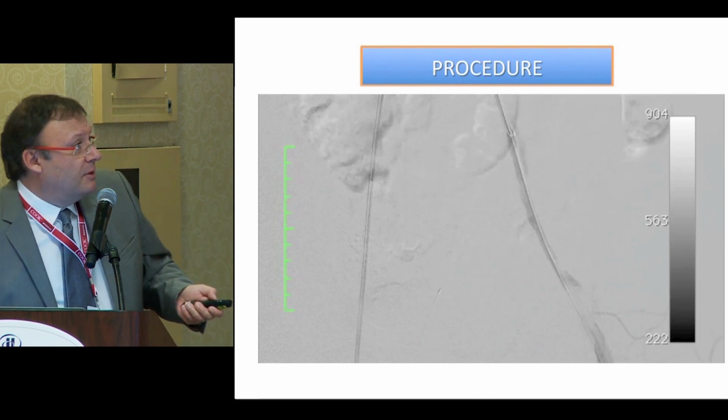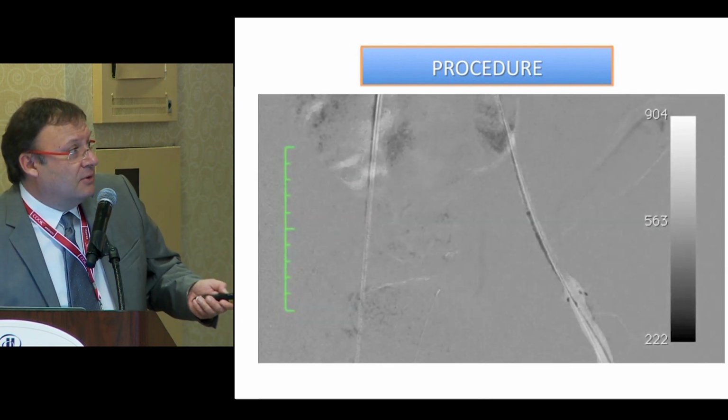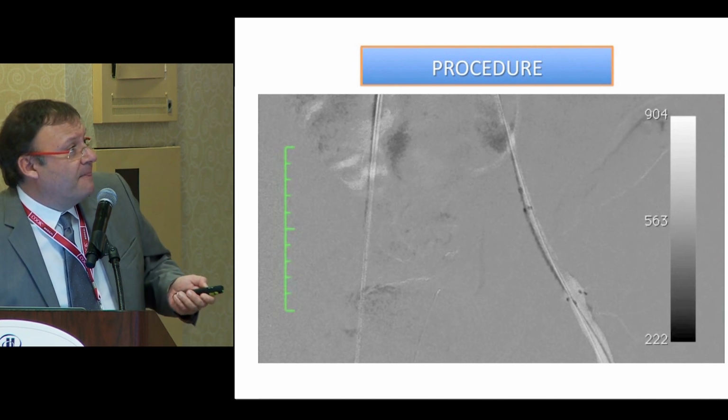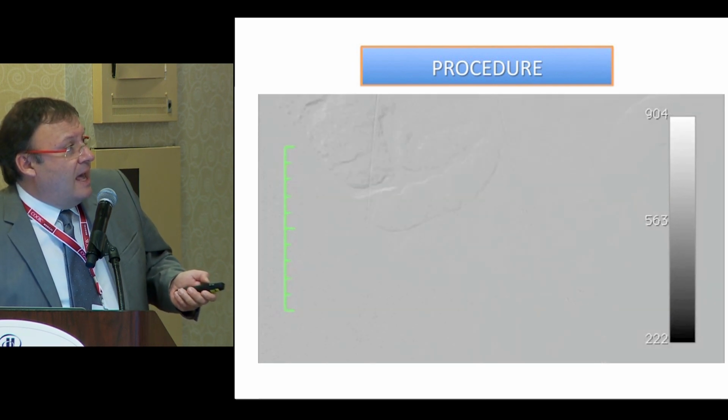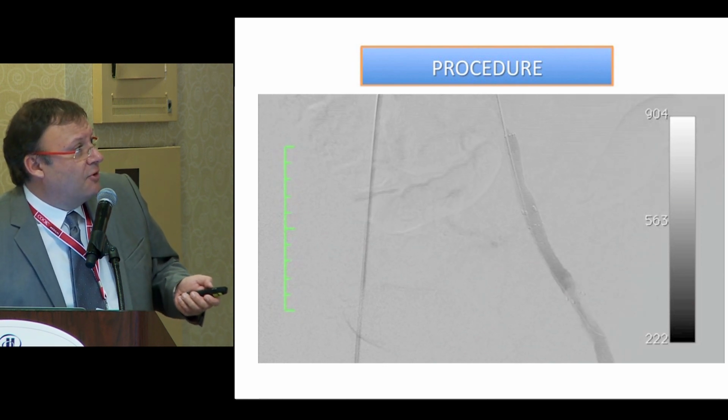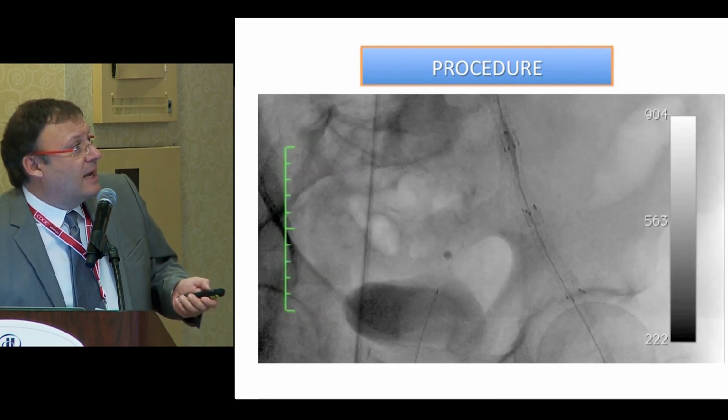We had to remodel all the external iliac we dissected before, with 2 stents.